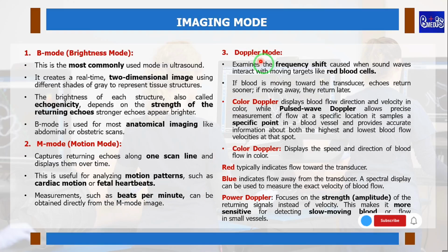We also have the Doppler mode. Here it examines the frequency shift caused when sound waves interact with moving targets like red blood cells. If blood is moving towards the transducer, echoes return sooner. If moving away, they return later.